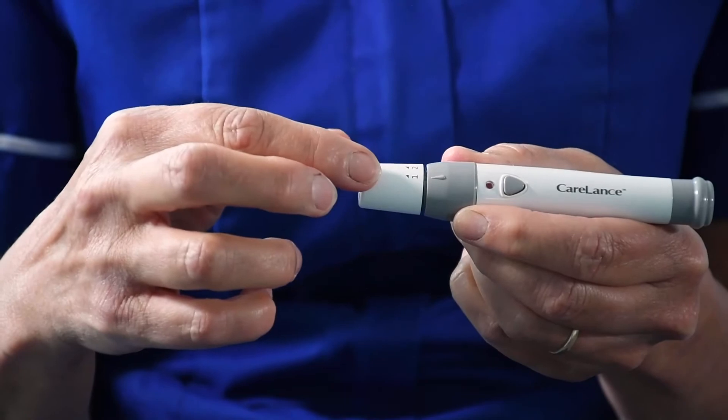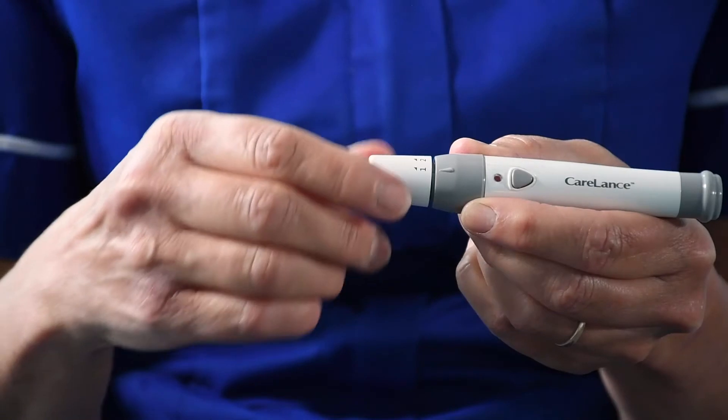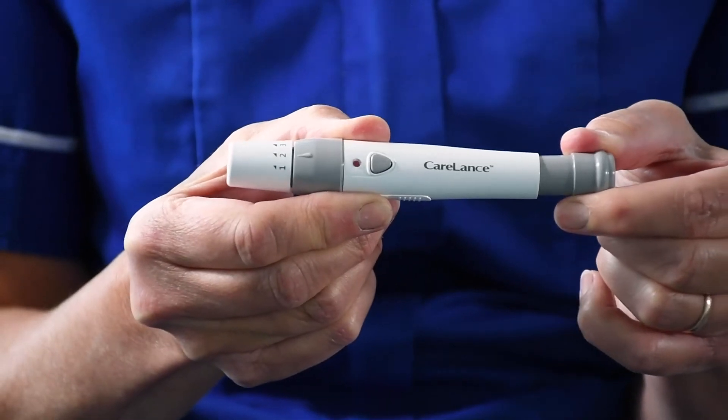You will notice on the finger pricker there will be a set of numbers — this is a depth gauge. The higher the number, the deeper the needle will go into the finger. We recommend you start with a depth gauge of one or two, and if this doesn't give you a good enough sample you can choose a higher number. The final step in the preparation of the pen is to pull the end of the pen out and release. The pen is now ready.